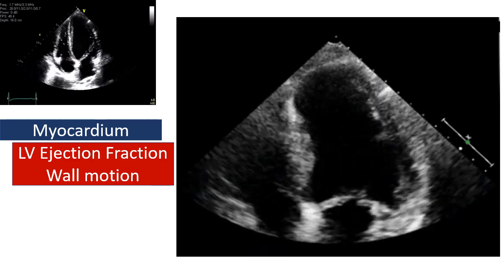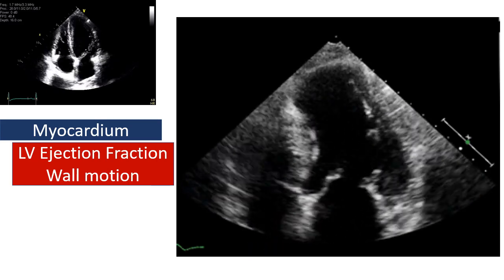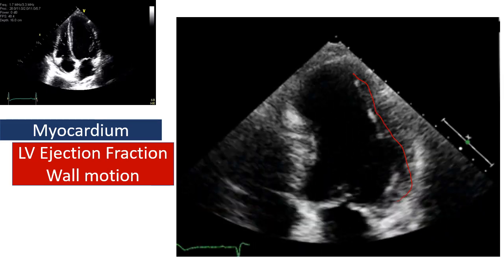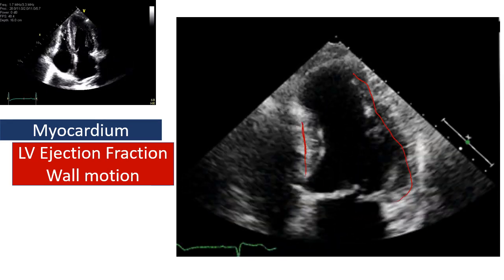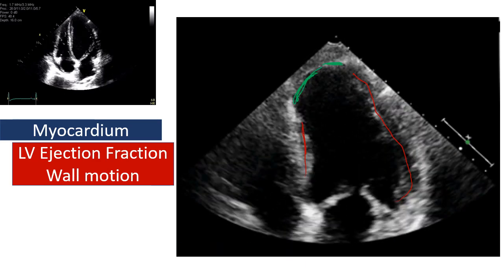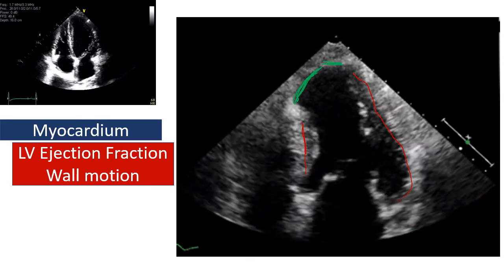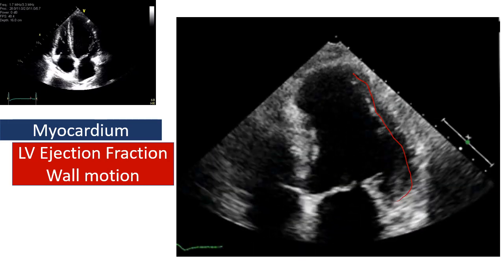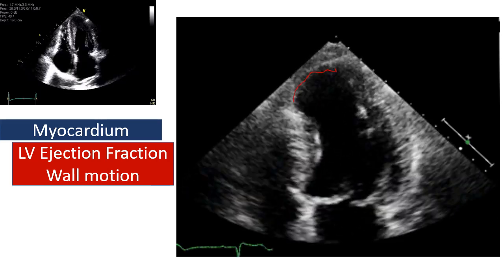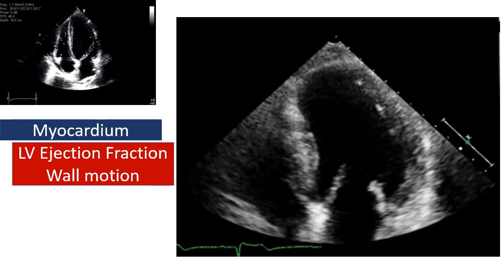This is another example. This is also an apical 4-chamber view, and you can observe here that the contractility in the anterolateral is not bad, and the basal and mid segments are also not bad, but there is akinesis of the apicoseptal, and this is called the apical cap. The apical cap and the apicoseptal segments signify also a presence of significant regional motion abnormalities. This part is akinetic. It's not contracting at all. It's not thickening, and it's not going inward. This is akinetic.